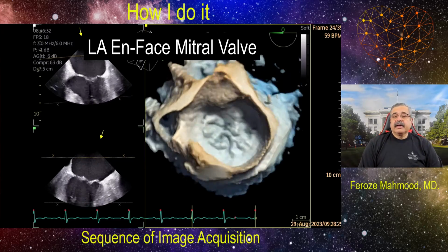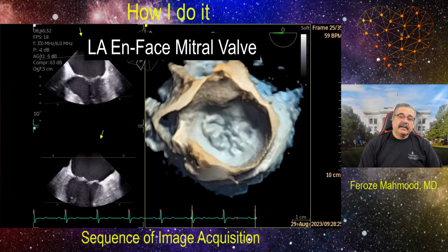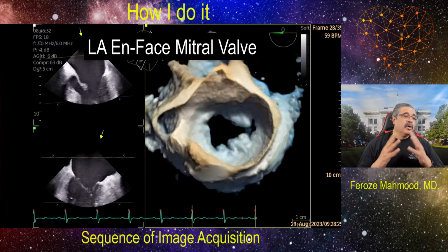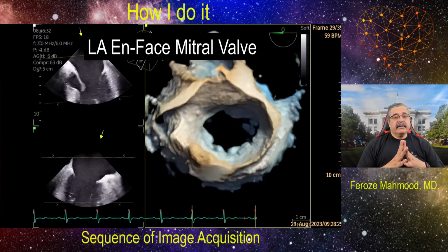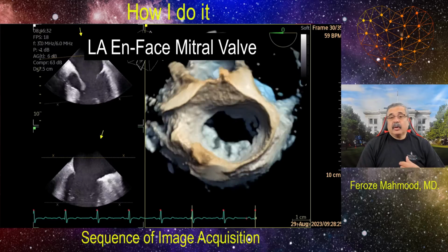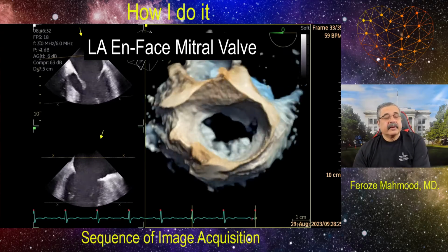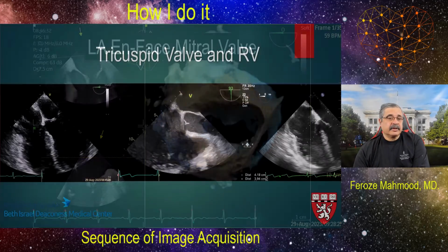Now, the key part is storing this raw data, that is the volumetric three-dimensional data. It gives you the opportunity to go back later on into a quantification software and do a clinical, research or any other quantification of the mitral valve that you can do later on while you're done with the exam and you're not being pressed to answer specific clinical questions.